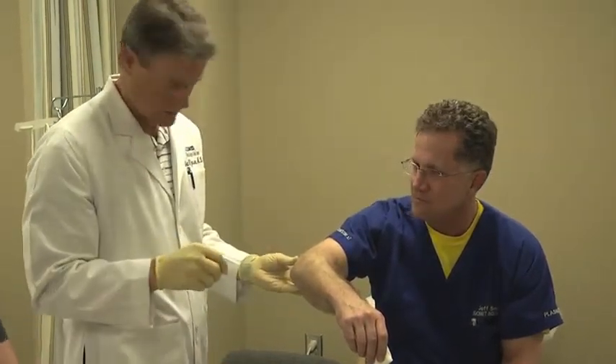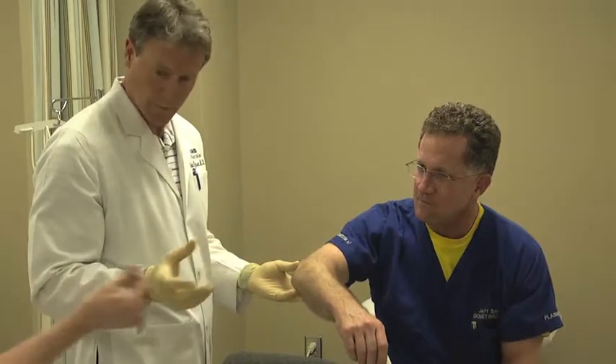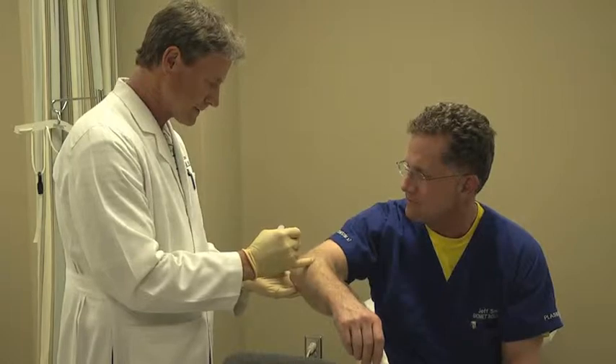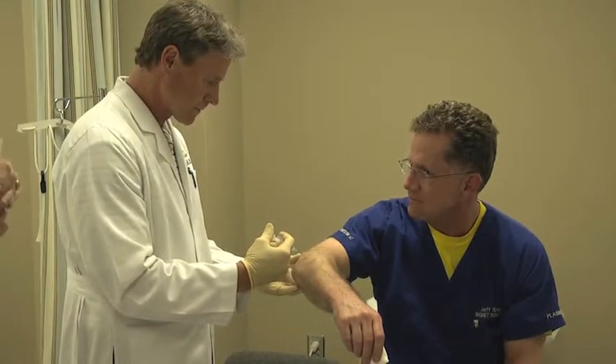We'll then prep the area and clean it, and we'll first inject an anesthetic into the skin, since the injection needle for the PRP is a little bit larger and can be uncomfortable.